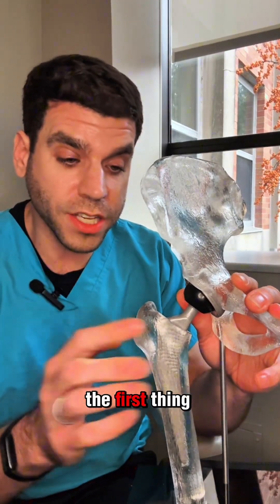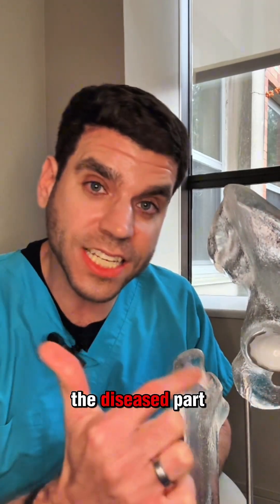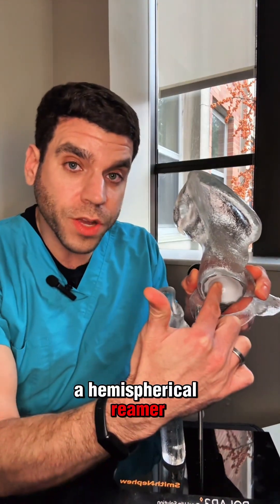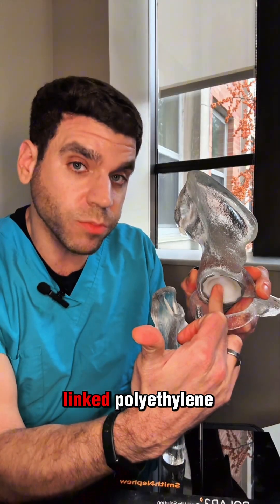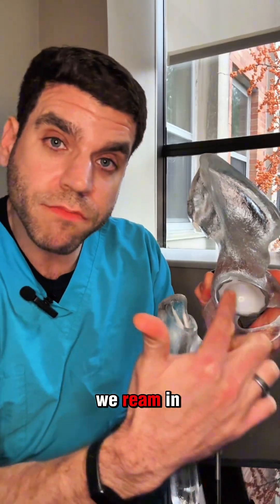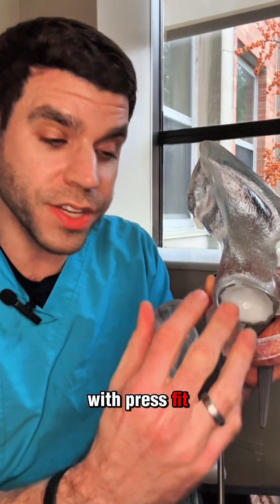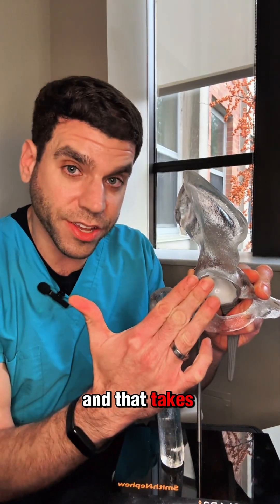When we go in and do a hip replacement, the first thing we do is cut out the neck and the head of the femur — the diseased part of the bone — and that allows us to expose the socket. We then ream it out using a hemispherical reamer, and put in a titanium cup and a plastic insert made out of highly cross-linked polyethylene. The hole we ream in the pelvis is slightly smaller than the socket itself, so it's jammed in with press fit, and it has a porous surface on the back for the bone to grow into it.